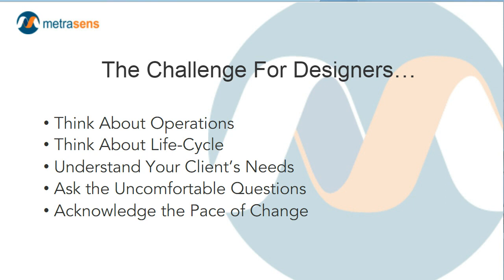Acknowledge the pace of change. MRI as a clinical service, the economics underpinning it, the technology, the types of patients and types of exams that we're doing is changing with dramatic speed. And replicating a design that you did 5 years ago is probably a significant disservice to a client today. We need to look at the pace of change, and we need to do a little bit of crystal ball gazing to identify what we think that means going forward.